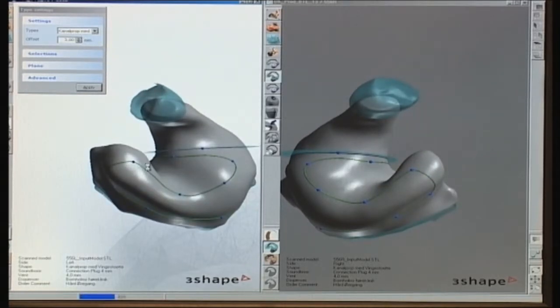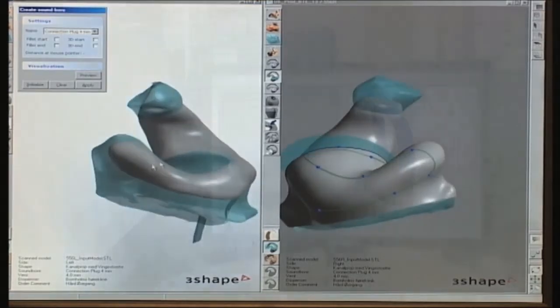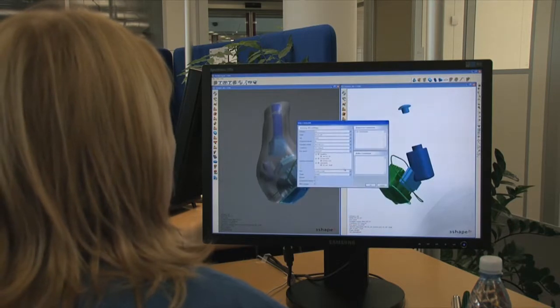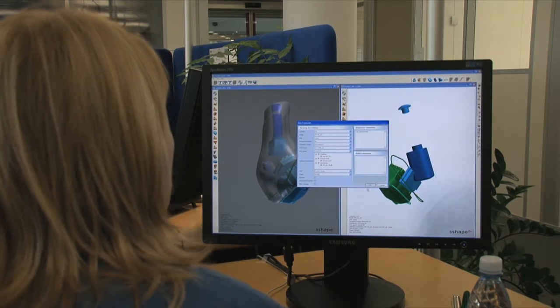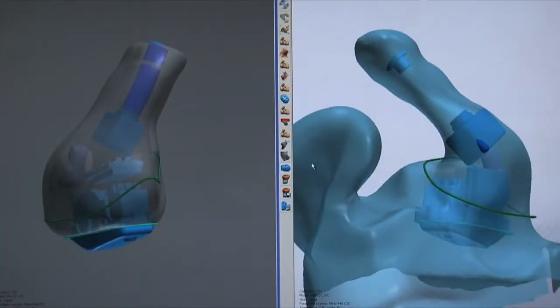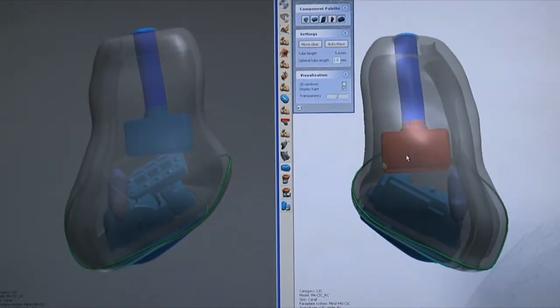This virtual shell is an exact three-dimensional copy of the scanned ear impression. The virtual hearing aid electronics can now be placed in the virtual shell to make the smallest hearing aid possible. After the technician is satisfied with the fit, Kamesha creates the virtual hearing aid as a three-dimensional model.